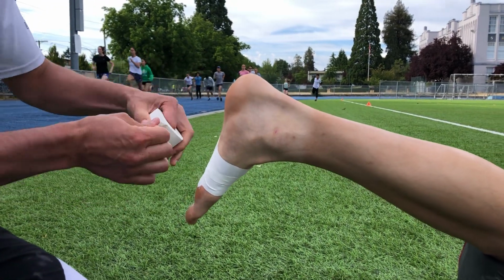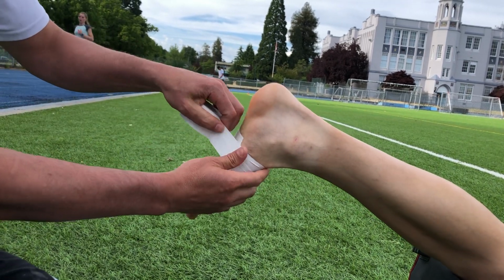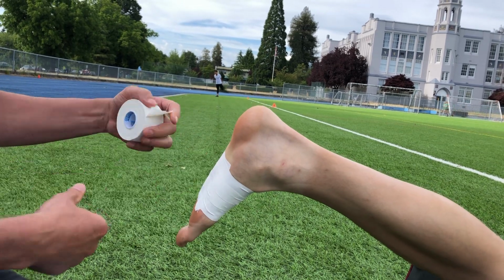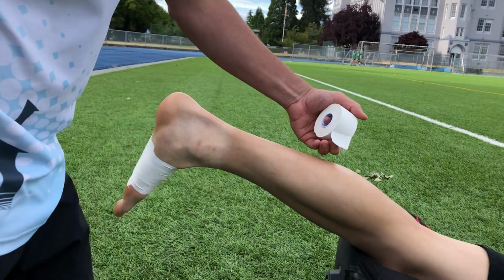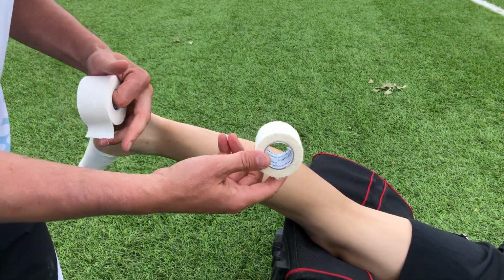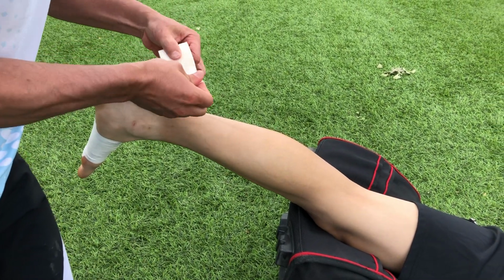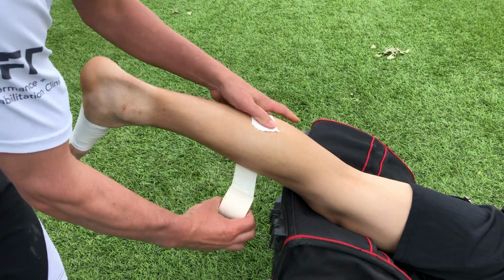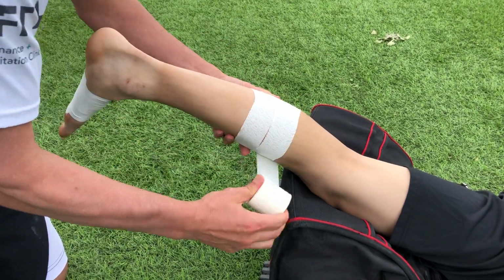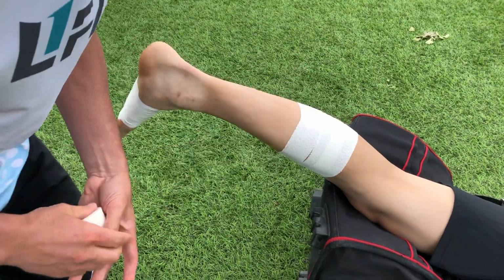And we can do 2 or 3 of these. This is going to take a beating, so it's nice to have some decent anchor to get into. Up top, we could use zinc oxide tape, or if we've got a nice budget, we could use Lightplast Pro. Some kind of rippable elastic tape is nice, so it's going to move and stretch with you. It's also a little easier and faster to apply because you can just go around a couple times. So we've got a big anchor strip up top.